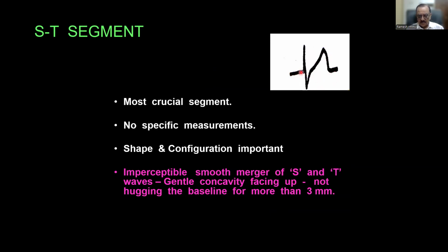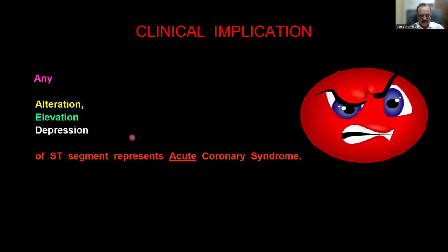It is the PR segment. We take the PR segment as the baseline. This is the baseline. This is the normal shape and configuration of the ST segment. Please remember, any alteration, anything which is not fitting in with this ST segment configuration is pathology.